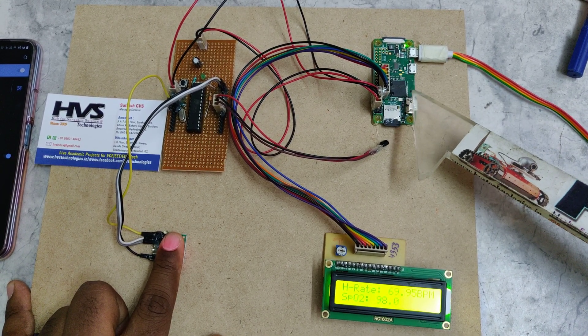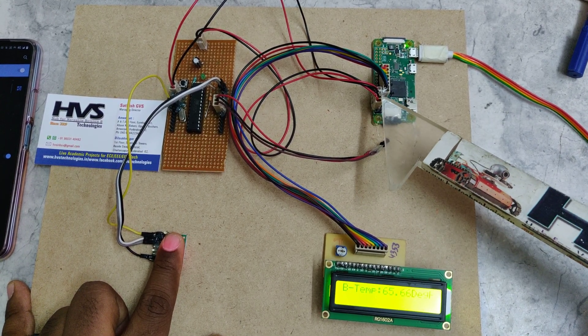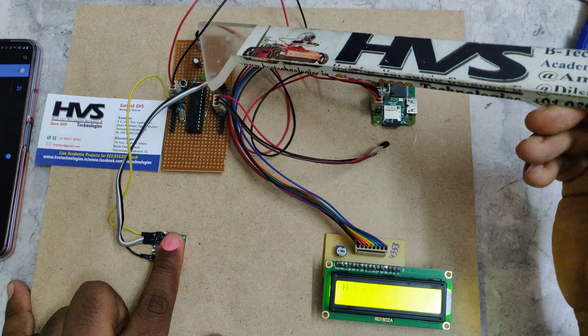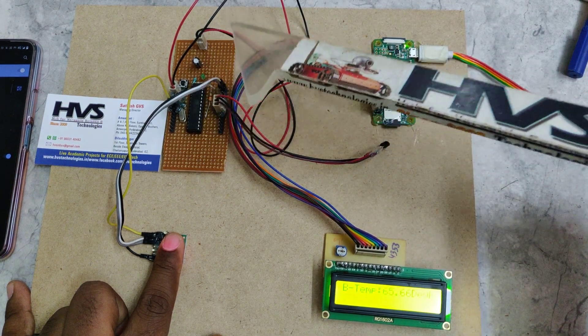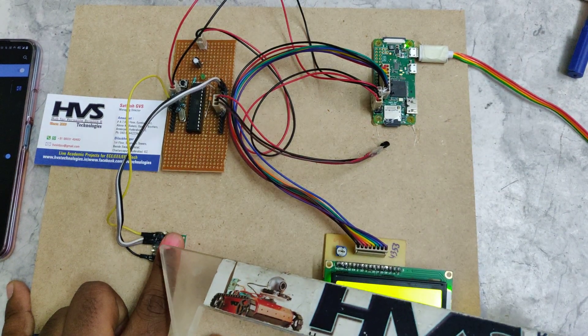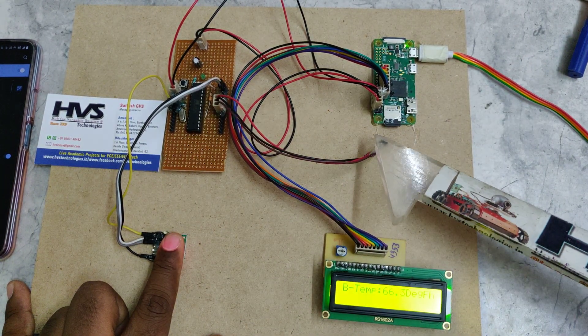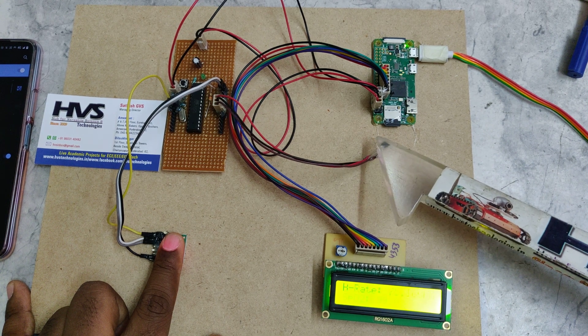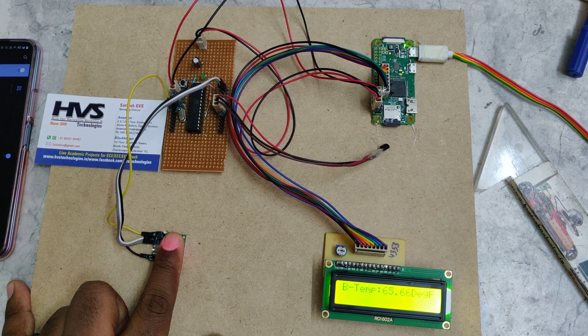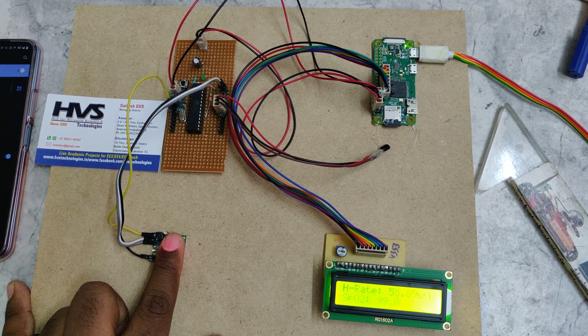We are using the Pi Zero W because of the inbuilt wireless communication Wi-Fi. From here we are going to provide the 5 volts power supply to the Pi Zero and it will distribute the power supply to this board, and from here we distribute the same power supply to the MAX30100 as well as LM35 sensor.